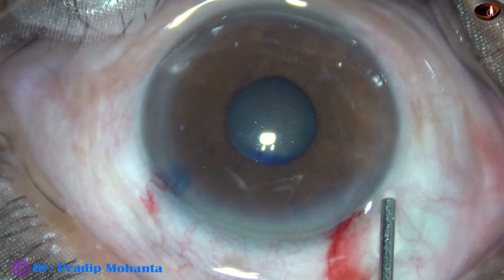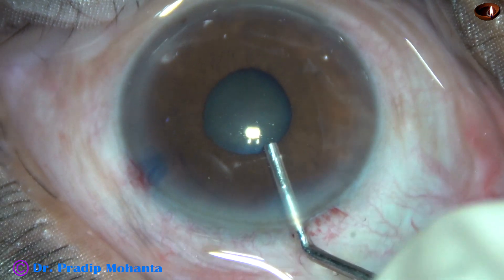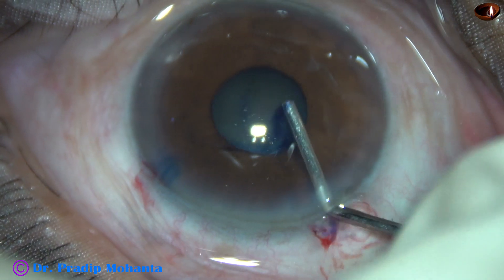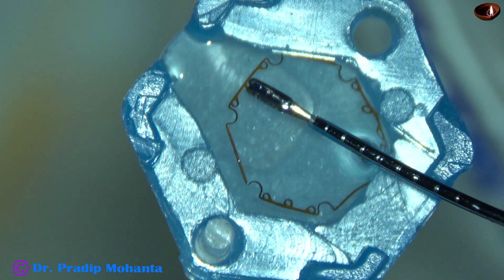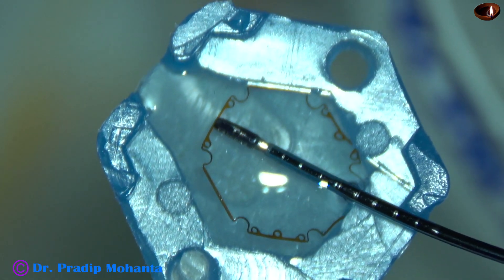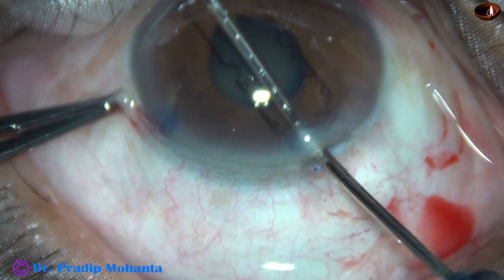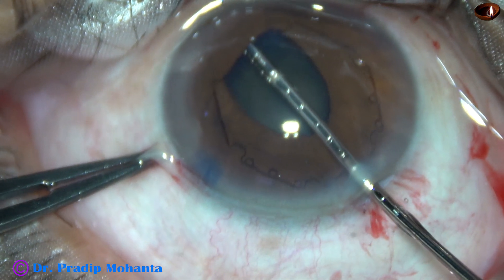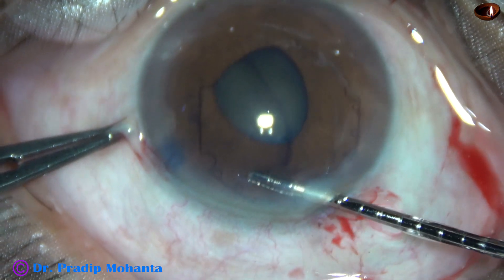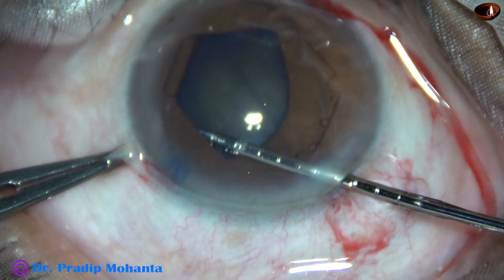So in this case, I have decided to use a pupil expansion device. The pupil expansion device I am going to use is the B-hex pupil expander. Here goes the B-hex pupil expander — the device is taken completely into the anterior chamber and the leading flange is tucked. Then the flange on the left side at around 1 o'clock is tucked.